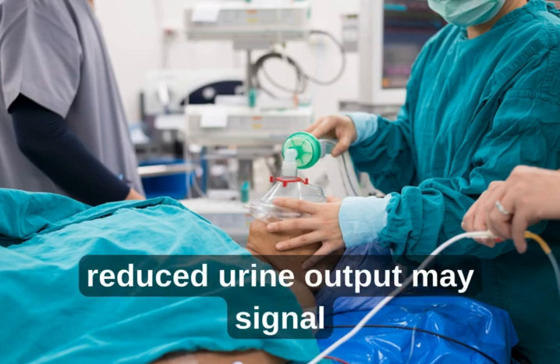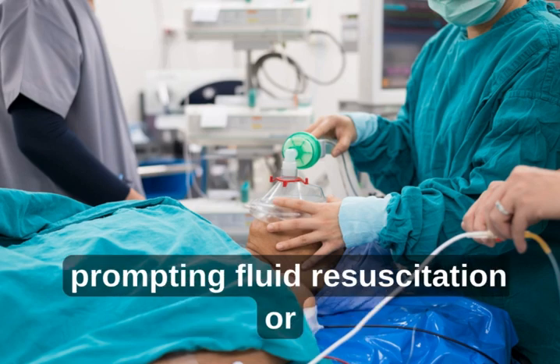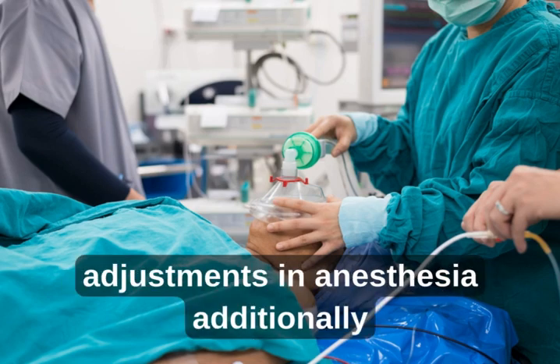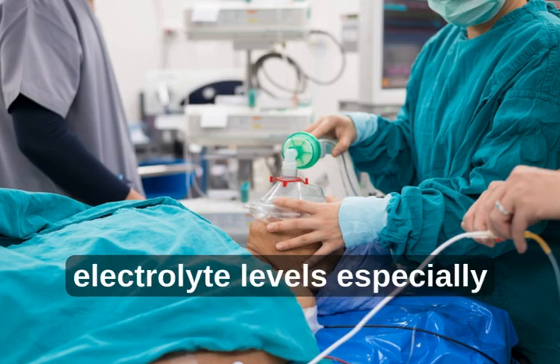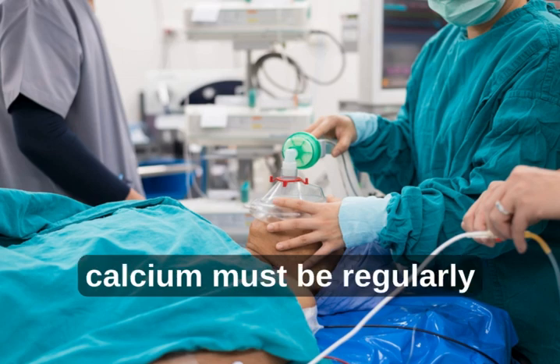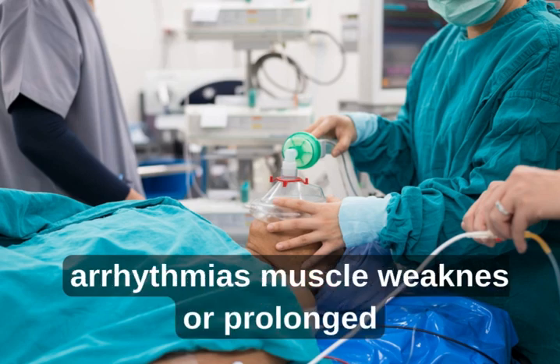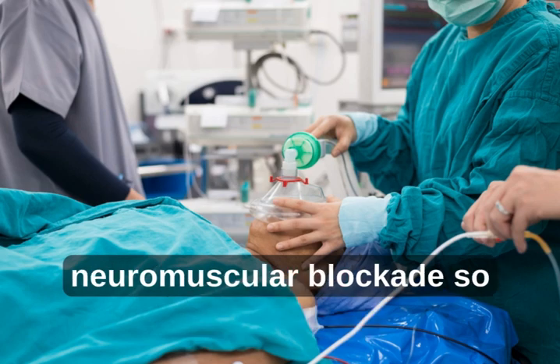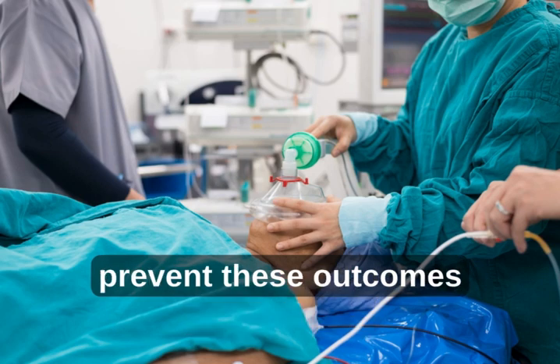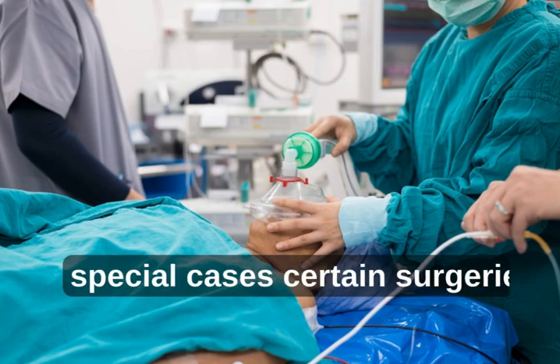During surgery, reduced urine output may signal hypovolemia or renal compromise, prompting fluid resuscitation or adjustments in anesthesia. Additionally, electrolyte levels, especially sodium, potassium, and calcium, must be regularly monitored. Imbalances can lead to dangerous complications like arrhythmias, muscle weakness, or prolonged neuromuscular blockade, so timely interventions are essential to prevent these outcomes.